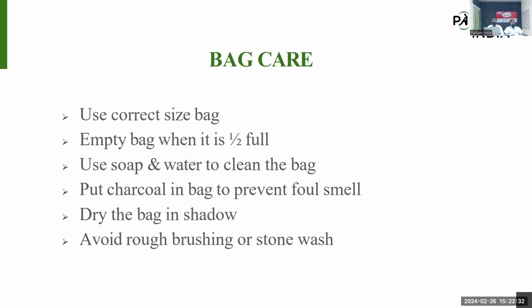We need to educate the patient and caregiver to avoid rough brushing or stone washing, otherwise it may tear the bag and cause leakage. Next slide.